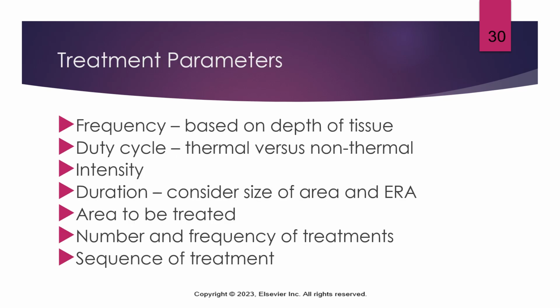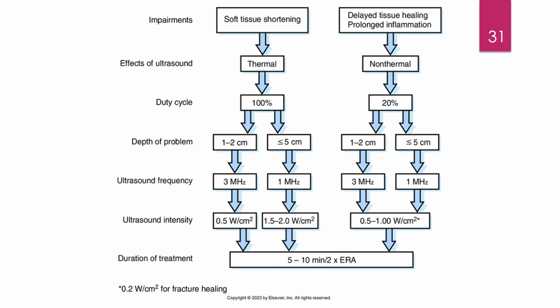Okay, so we're going to actually just move past this slide here because I want to show you this last little piece. This is probably going to be your best friend when learning these parameters for therapeutic ultrasound. This table is great. It's in your book. You can check it out. But I like it because it breaks it down into essentially two main columns. So we're looking at, on the left-hand side, essentially thermal application of ultrasound, and on the right-hand side, non-thermal application of ultrasound.